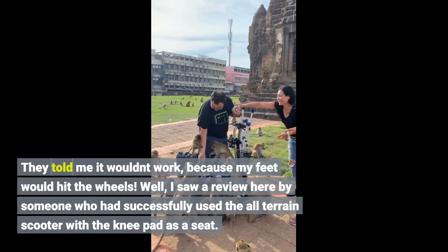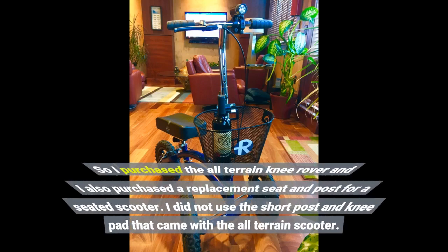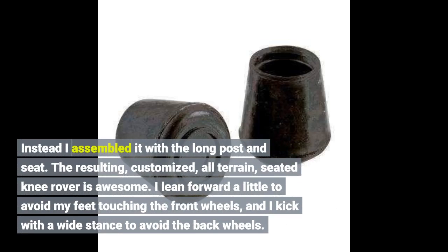I saw a review here by someone who had successfully used the all-terrain scooter with the knee pad as a seat. So I purchased the all-terrain Nirover and also purchased a replacement seat and post for a seated scooter. I did not use the short post and knee pad that came with the all-terrain scooter.